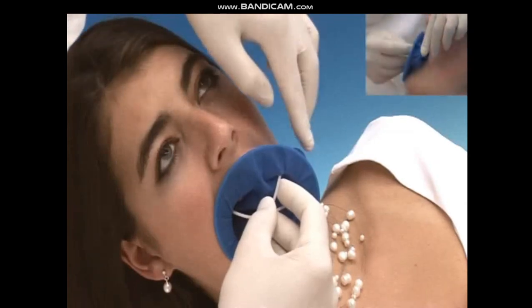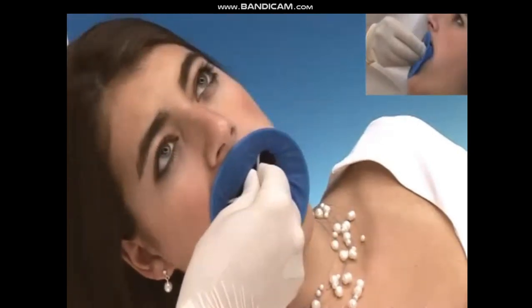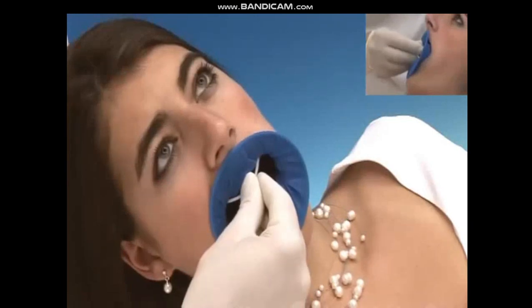In the second step, place the second wing behind the second corner of the mouth. This can be achieved with or without using a mirror as an aid.